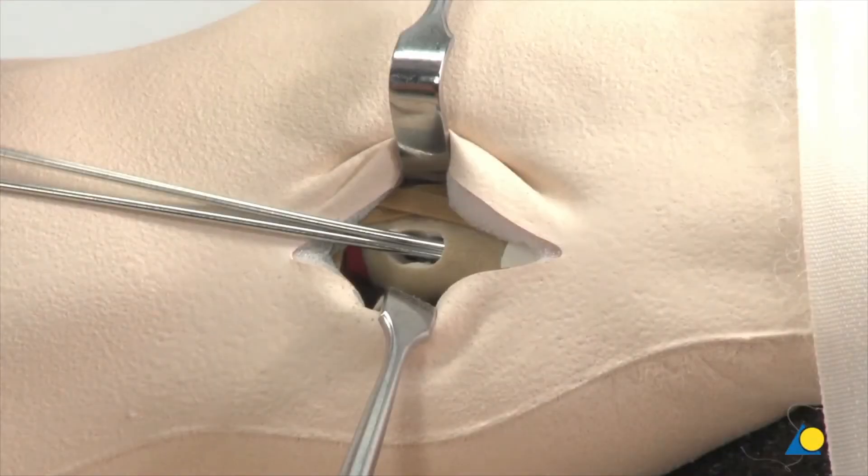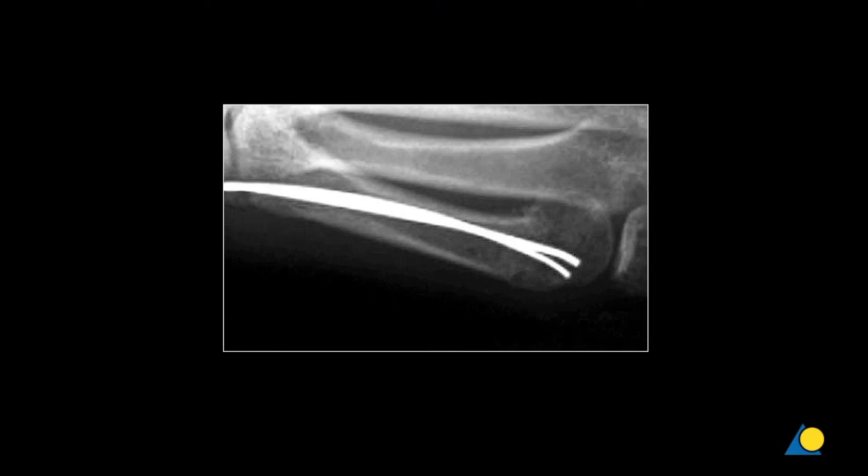On the model, the position of the wires in the medullary canal and the result of the reduction of the fracture can be checked by opening the soft tissue cover in the distal direction. Under clinical conditions, the position of the K-wires would be checked using the image intensifier. The subcapital fracture is fixed and stable under load. The reduction is correct.